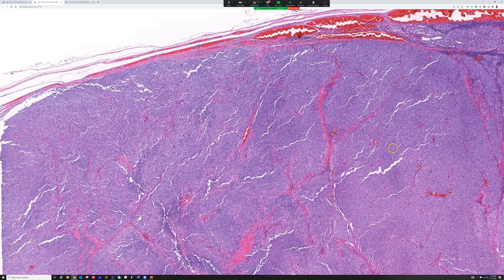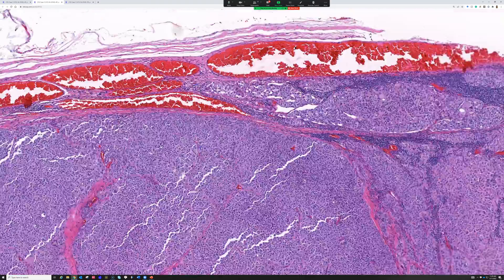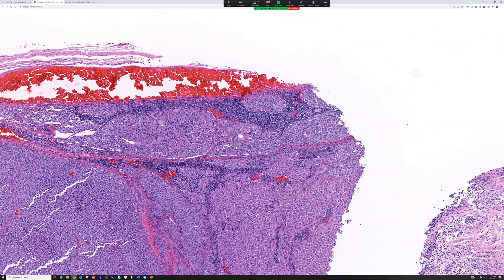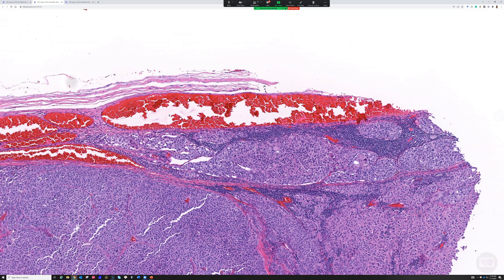I would get an INI-1. INI-1 can be lost in a growing list of different tumors. The main one I think of is epithelioid sarcoma, but there's also rhabdoid tumor — there's rhabdoid tumor of the brain called atypical teratoid rhabdoid tumor, one in the kidney, and extra-renal rhabdoid tumors. These overlap with proximal-type epithelioid sarcoma: a highly malignant, rhabdoid-looking tumor that usually expresses keratin and EMA and has loss of nuclear INI-1 expression.